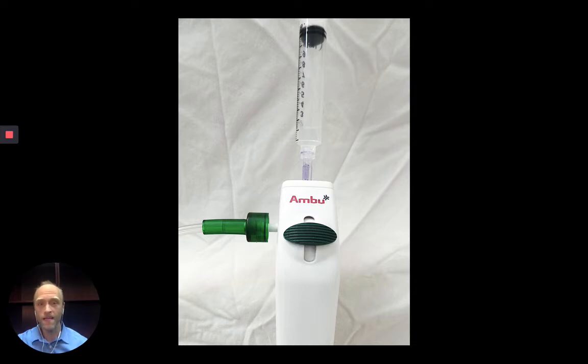In my experience, when delivering lidocaine through the scope, people tend to give more volume than is necessary. Patients generally need only an additional 1 to 2 mL of lidocaine. So in order to deliver that, fill the syringe with lidocaine along with 8 mL of air in order to push the liquid through the working channel of the scope and drip it onto the epiglottis and larynx. Now that the patient is adequately topicalized, it is time to insert the device and deliver the tube.